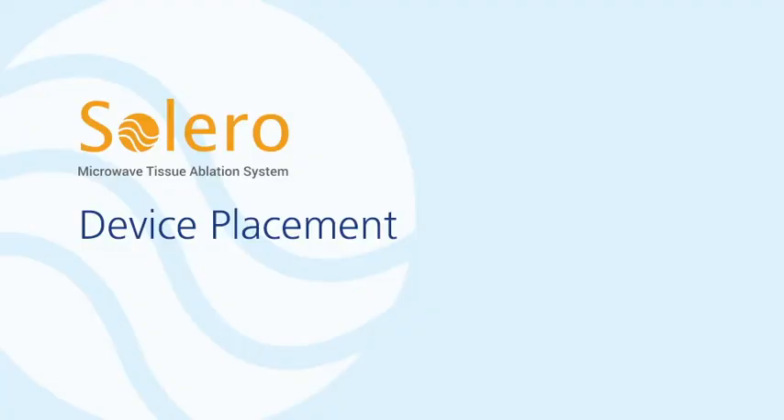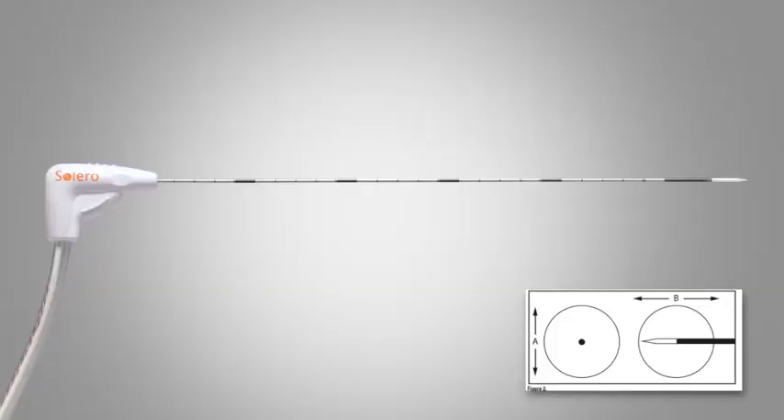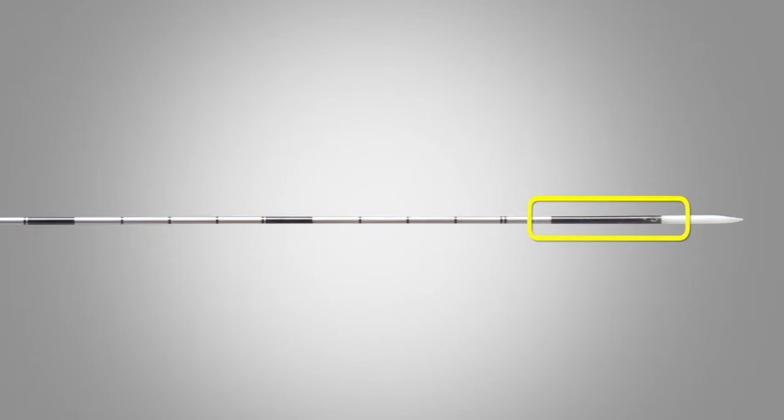Device placement. Using imaging guidance, such as ultrasound or CT, determine the target location for ablation and insert the Solero applicator using clinician preferred methods. Next, place the transition of the stainless steel shaft and ceramic tip at the center of the intended area of ablation. Make sure that the black shaded area on the metal shaft of the device is fully embedded into the tissue.